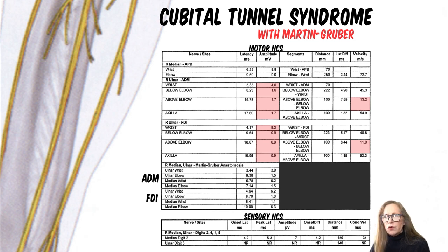Really strong number of nerve fibers there, but the patient can't get at them at all. This is very severe ulnar nerve. So why is it 8.3? Well, what you'll see your electrodiagnostic people do is they'll look then for Martin Gruber. And what they look at is they stimulate the median nerve at the elbow, and then they stimulate the median nerve at the wrist, and they're stimulating above and below where a Martin Gruber would come off.